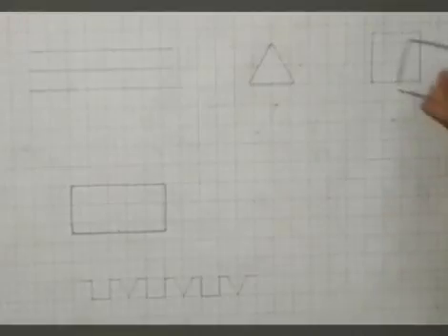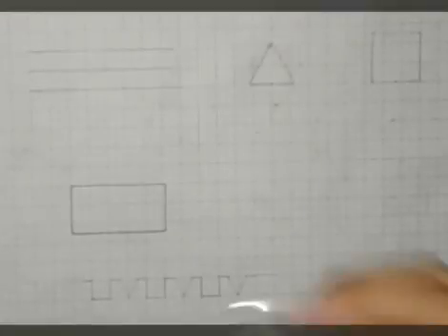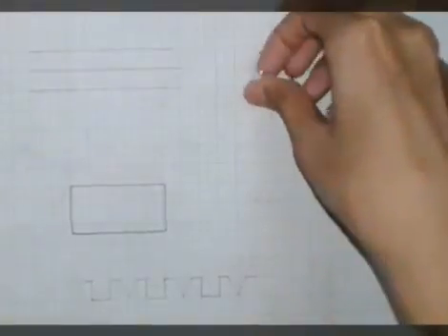I am now showing the square. This is a square. We want to adapt it accordingly and bend the wire as a square, and then followed by the rectangle. For the rectangle, we want to bend and adapt it, and then the triangle. After this, we want to do the U and V and circle.